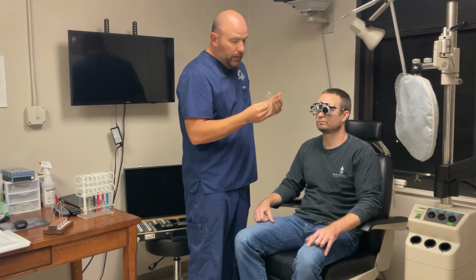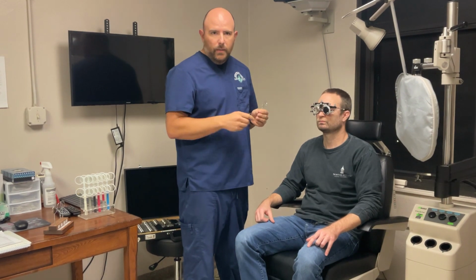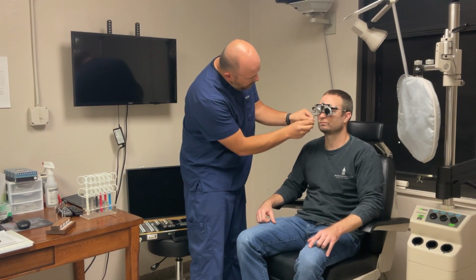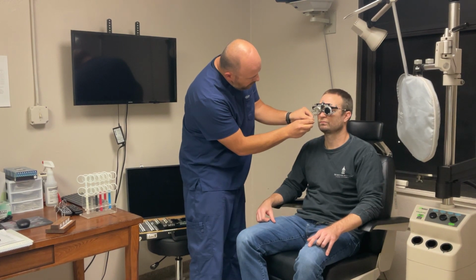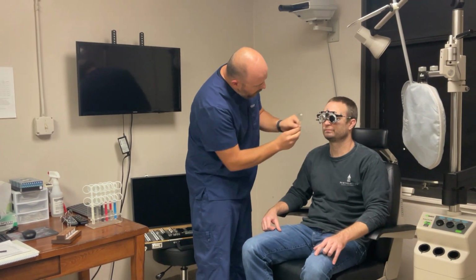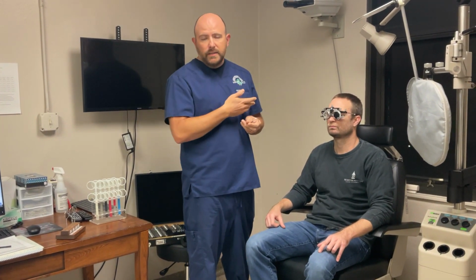Okay, and just repeat until the patient notices either neutrality or they want to go back up to more minus. All right, better 1 or 2? 1. 1 was better here? Mm-hmm. Okay. So now we've reached kind of an interesting point because the patient is wanting to effectively kick out all of the cylinder. So this may be true. The patient really may not need any cylinder at all, or the axis may be a little bit off.